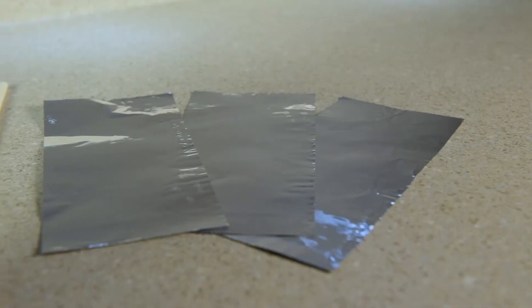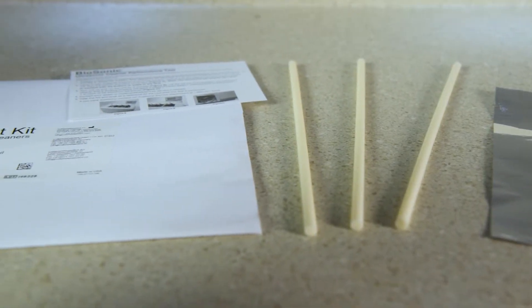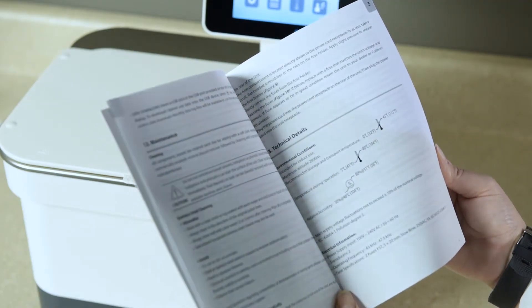Unpack your foil test kit. Inside, you'll find three pieces of foil, three hanger rods, and the instructions for performing the test. If you do not have the FT1 foil test kit, check your UC150's manual for alternate instructions.